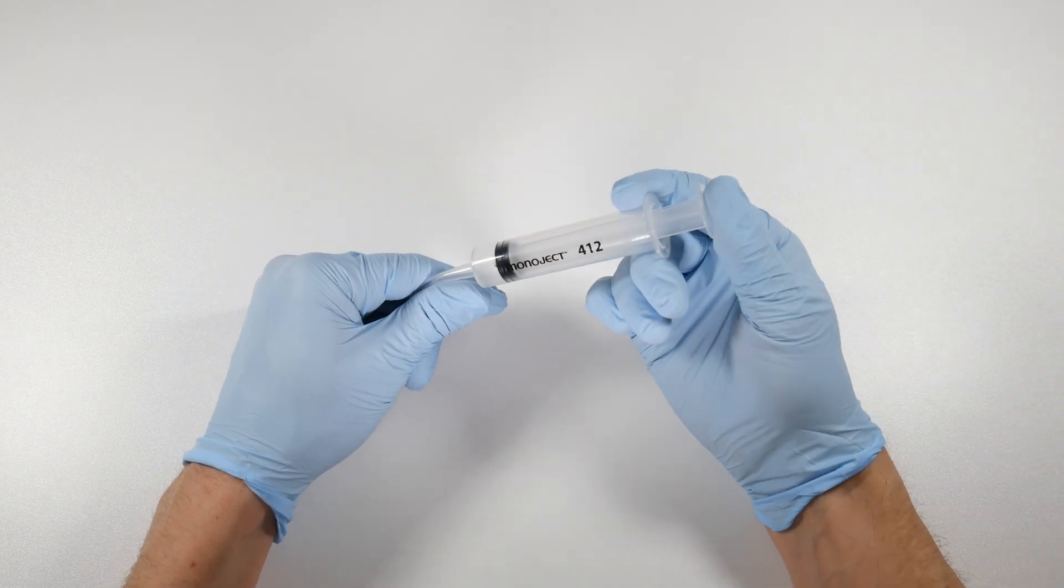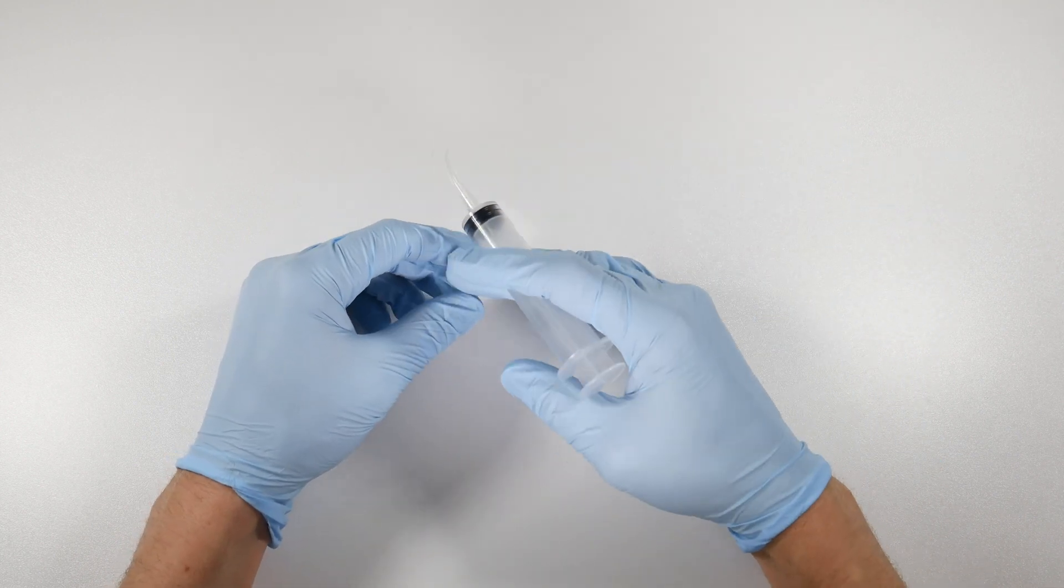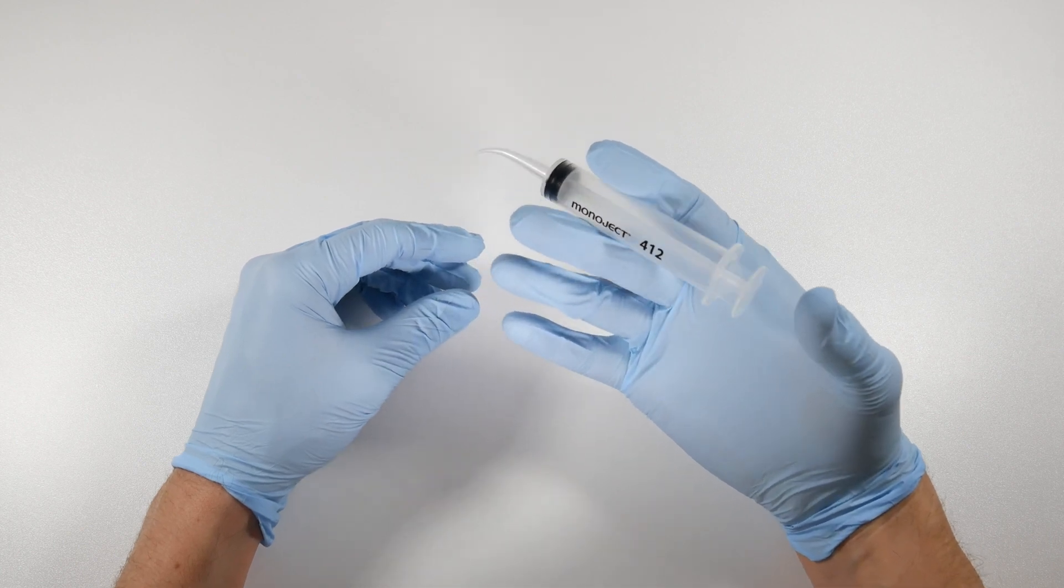When you remove the tooth, have this thing ready to go, pick it up off your tray, spray it in the socket, get everything nice and clean in there with the suction, get the suction out of there and allow the socket then to fill up with blood one more time.